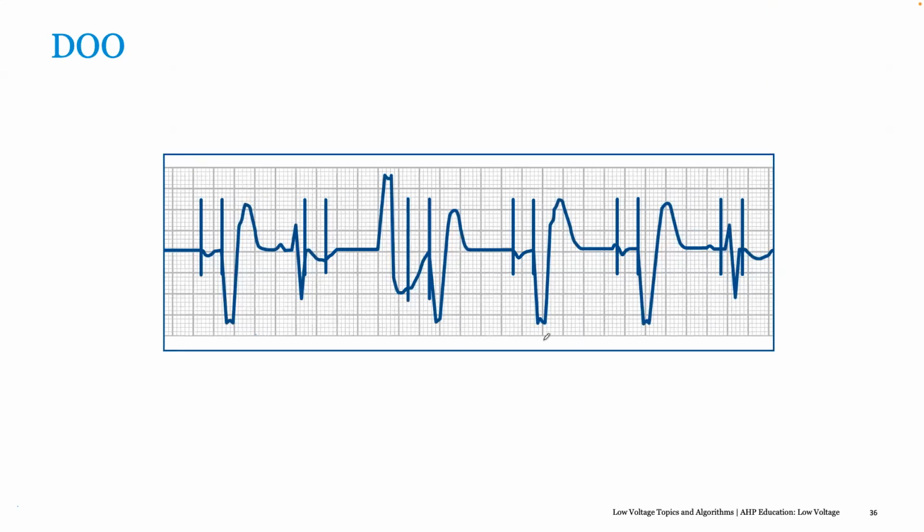Just a question there, AJ. I get given a load of leads and I've never ever seen a lead that does that. Does that lead have a special name, or is it a very special device you need to use if it can sense only in the atrium and pace in the ventricle? So it won't need a special device because the lead looks kind of like the DF1s, where it bifurcates. It has a ventricular plug and an atrial plug on the lead itself. So it's got two plugs on it. Exactly. Okay.